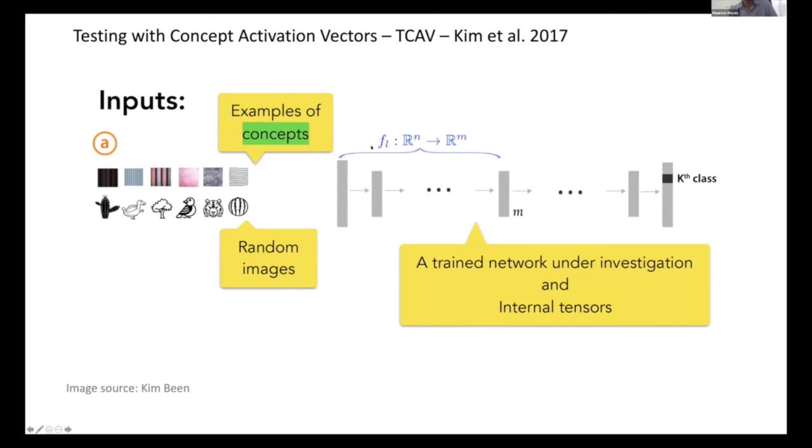So you can see this first part here until this layer here corresponds to a representation of the input data. So you can imagine that what I receive here is a description of the input here. And I'm going to then call that F_L, for layer L, a descriptor F.